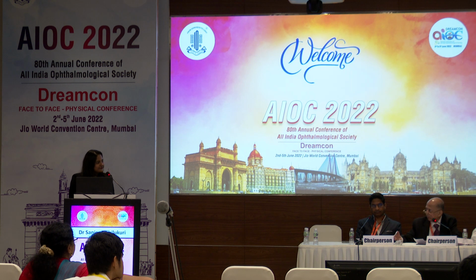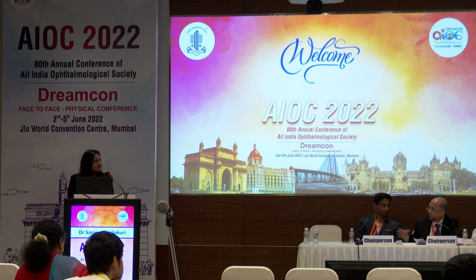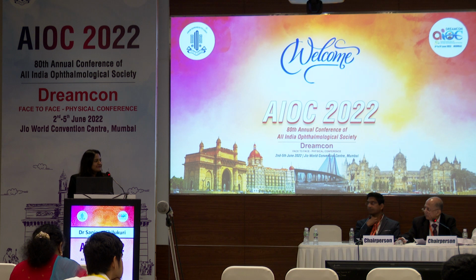How do we confirm that there are no fundus changes? First is by direct visualization of the fundus, and second by doing some invasive test which has an established role. So had you done fundus fluorescein angiography and said that we did FFA and there were no microaneurysms, there was no change in the vessel caliber, then perhaps, but anyway, good.